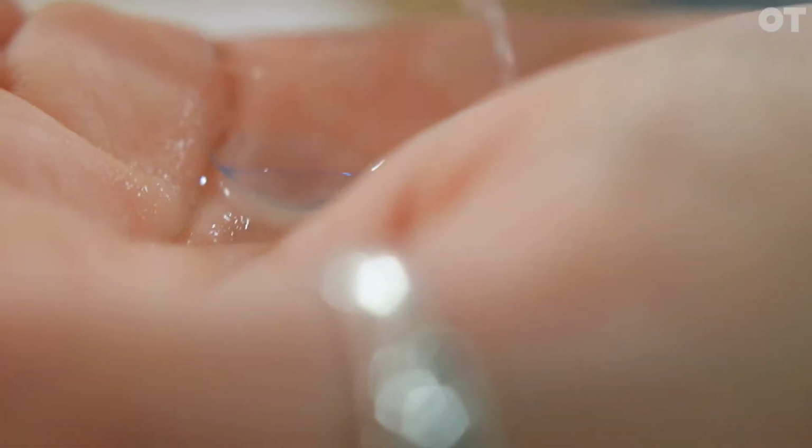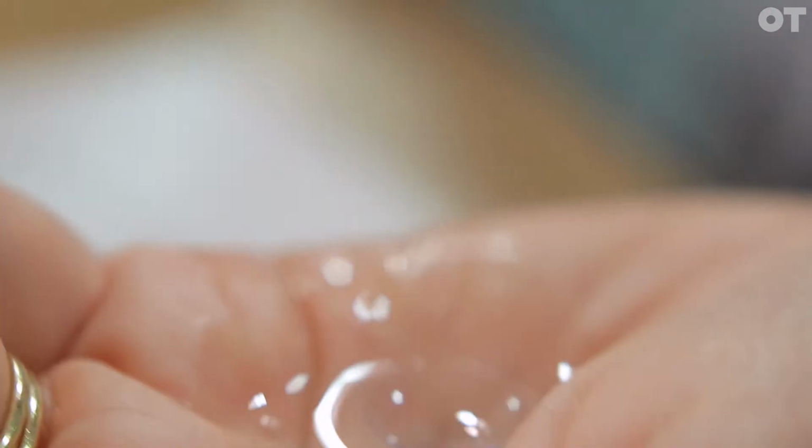We dry them very thoroughly, make a bit of a show of cleaning the surface that we used beforehand and laying out some paper towels so that they see me make that area hygienic to start with. And then of course if they're touching their eyes and then they do this on their jeans, which they usually do, and then back to their eyes, wash your hands again. You drum that in from the start.